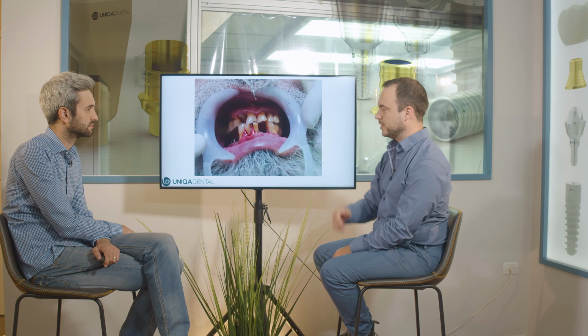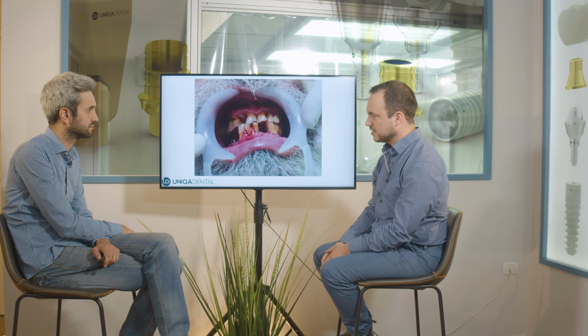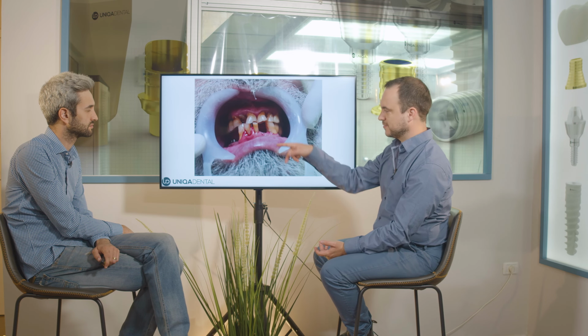First of all, we took impressions with transfers at implant level with plastic caps, connecting the transfers to the implants. We cleaned the teeth. All of those teeth we need to extract. We have a very large bone loss and gingival recessions. Those teeth are problematic, with gingival recession and bone loss, in a very problematic periodontal patient. Those teeth are for extraction. Probably nothing can be done with them. We have some spots of caries.